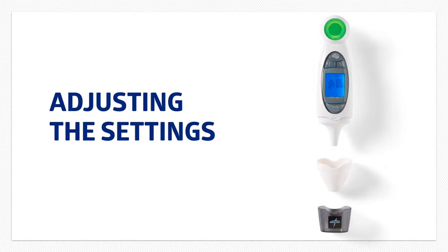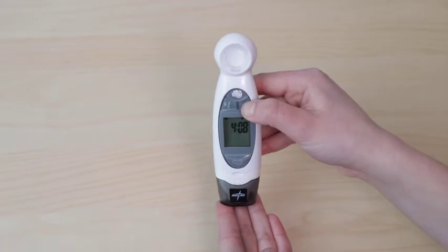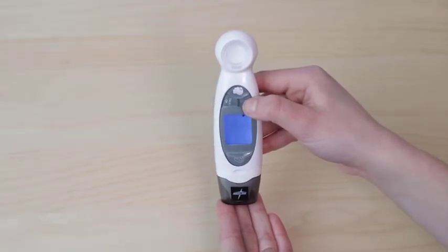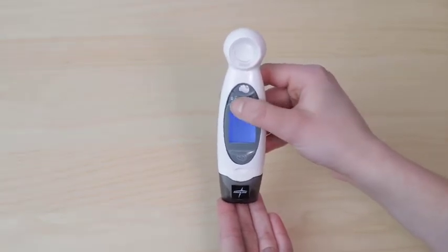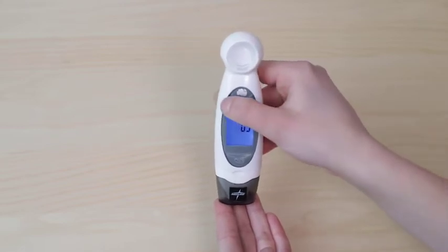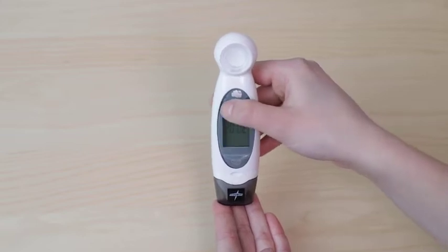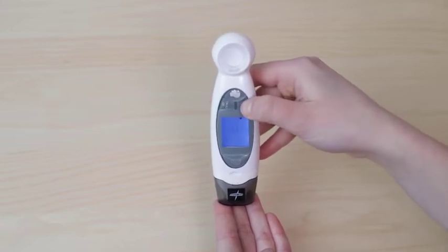Let's begin by setting the date and time. Press and hold the memory set button to go into the setting mode. Press the same button again to switch the hour mode between 12 and 24 hour formats. Press the talk OK button to switch between the setting parameters: hour and minute.